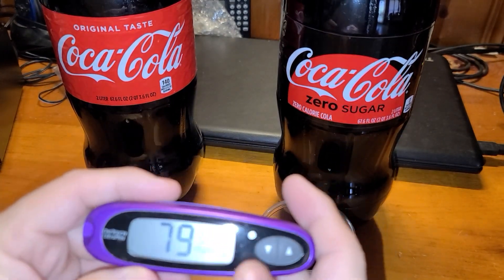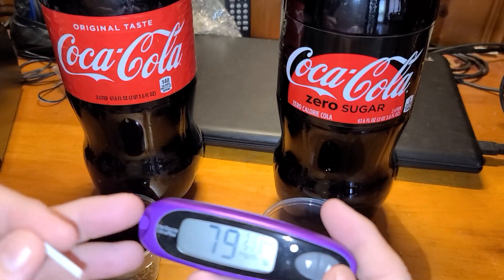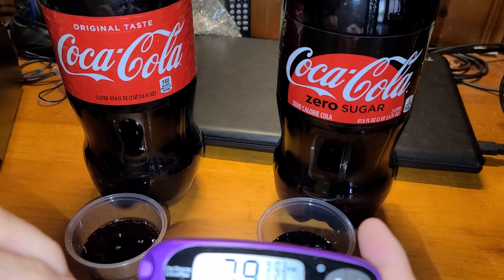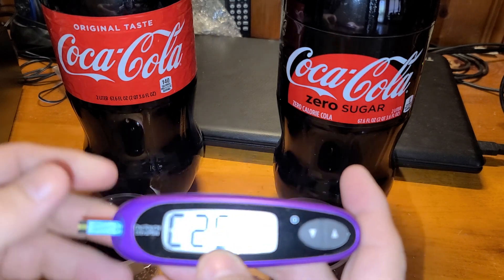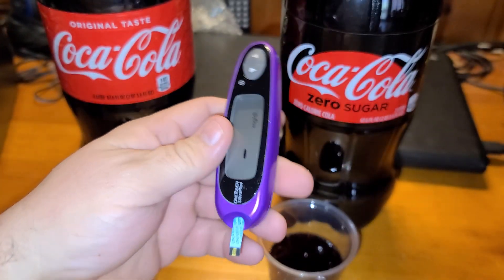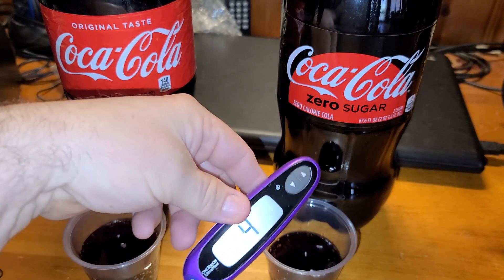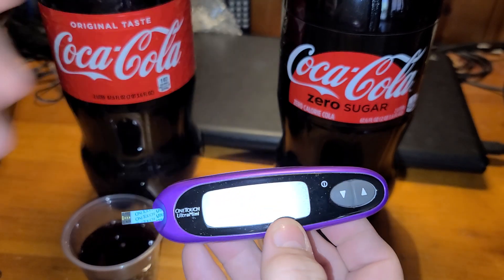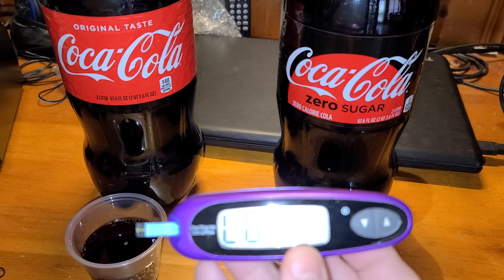Okay, so ignore the date being wrong. You can do these things in test mode so they don't affect your average. If you put this strip in here and dunk it in the Coke Zero, it'll show you whether you have sugar or not. On mine, it'll error out, which means extremely low — or low in this case. The Coke Zero showed low.